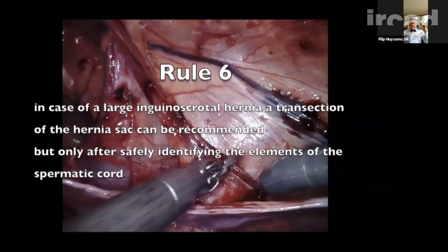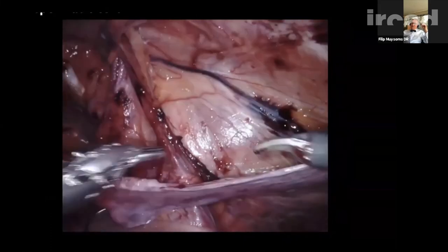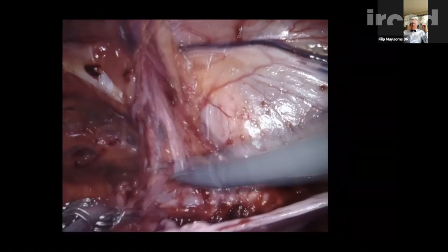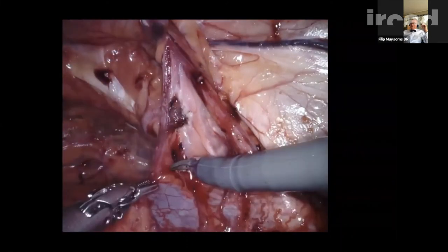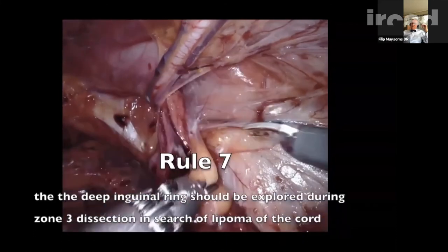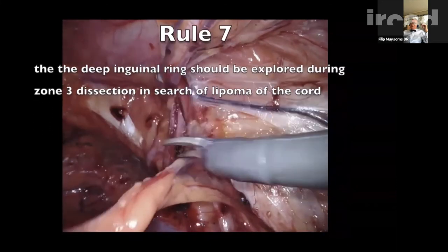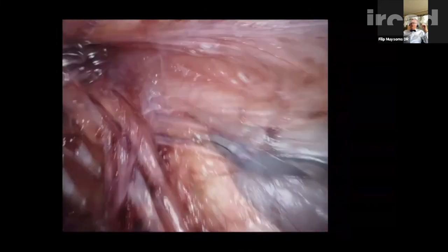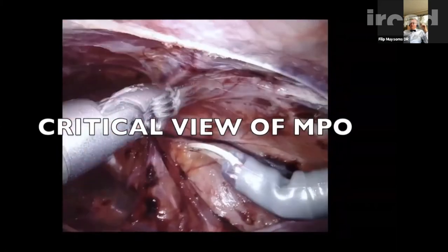Rule 6: if you feel obliged to transect the sac because it seems endless, make sure you've identified all cord structures including the ductus deferens before doing so. Rule 7: a cord lipoma — in this case not very large — is reduced. Sometimes lipomas are amazingly large when approached from the pre-peritoneal dissection view. This brings you to the critical view of the myopectineal orifice — your mesh must overlap 3–4 cm beyond any hernia defect, whether medial, lateral, or femoral.